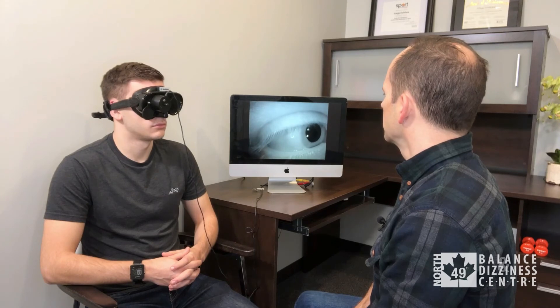Now we close the eyepiece so Zach is in the dark. Keep your head still, eyes wide open — look a little bit to your left, a little bit to your right, look up, look down. It's nice and solid, not bouncing around. So that's spontaneous and gaze-evoked nystagmus: looking straight ahead is spontaneous, looking to the sides is gaze-evoked nystagmus.